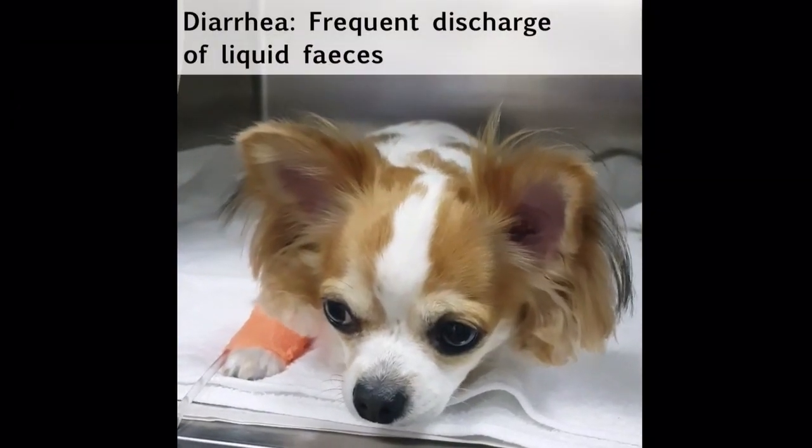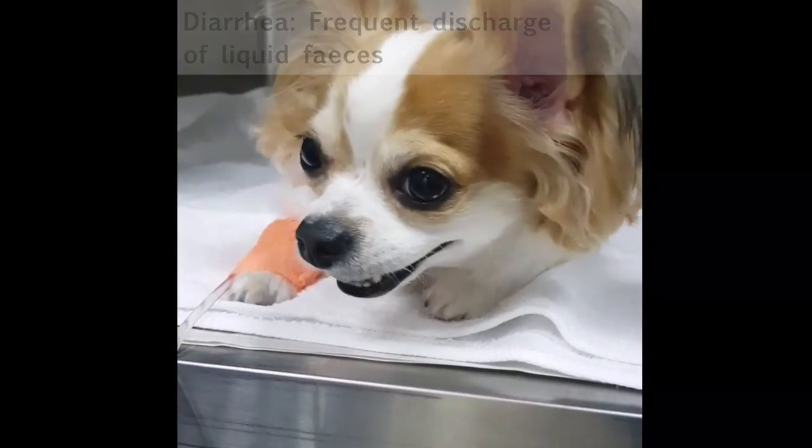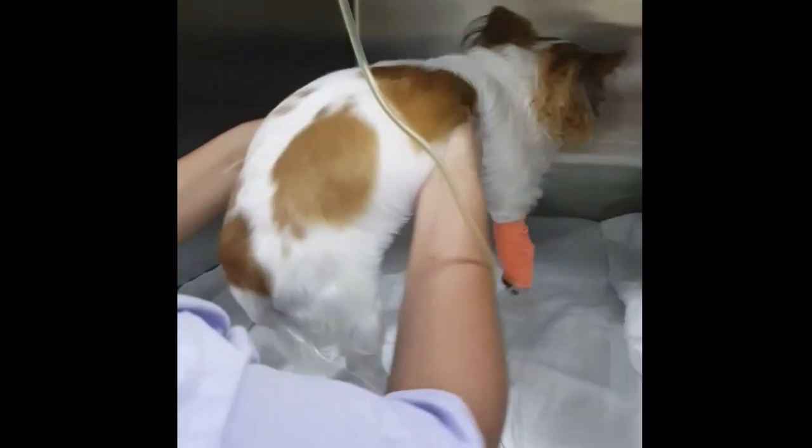On 27 March 2019, a Chihuahua was brought in because it had diarrhea for 2 days. Diarrhea occurs when feces are discharged from the bowels in liquid form. Diarrhea can occur because of many reasons, and one way to diagnose the pet's condition is coproscopy.